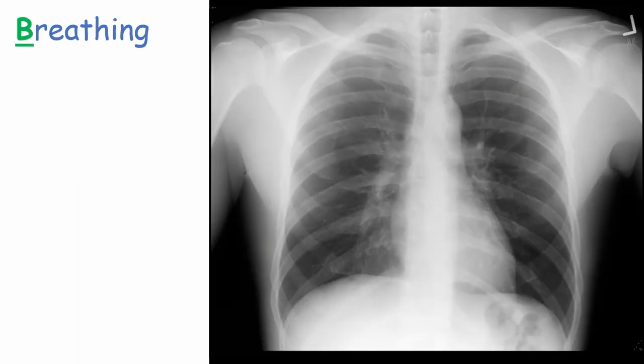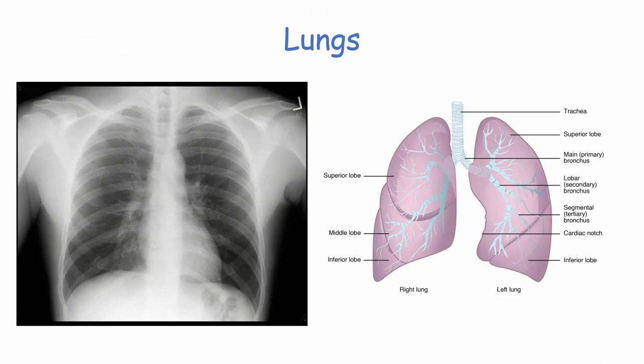B for Breathing refers to the lungs. The lungs on the chest X-ray should appear blacker than the surrounding tissue and should be mostly symmetrical in density. When describing areas of the lungs, we split them into upper, middle, and lower zones. These zones don't directly correlate with the anatomical lobes of the lungs, which are harder to identify on the chest X-ray.